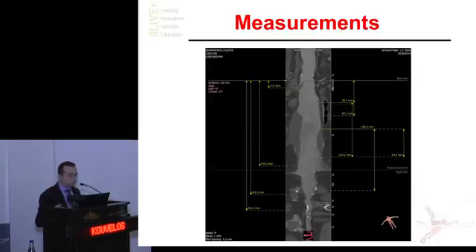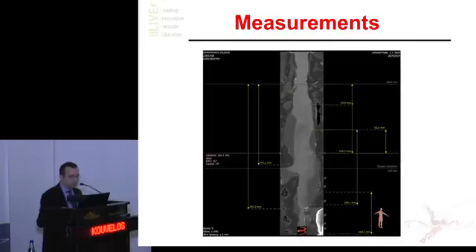We also have a 200 millimeter aortic bifurcation. And here's where we planned for the flow divider, and here's where we planned for the contralateral limb to open. This is the right side, and here's the left side.